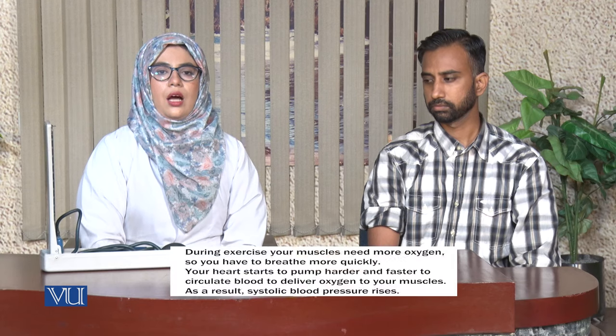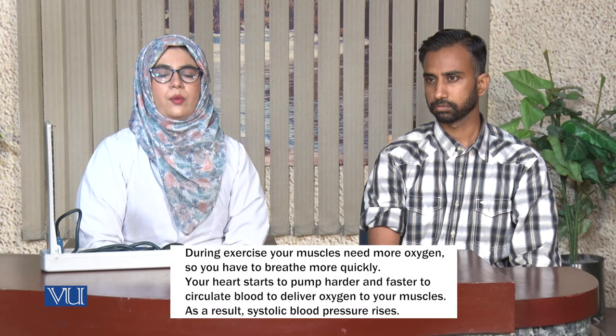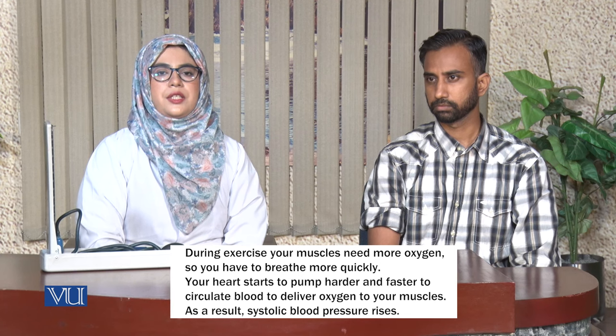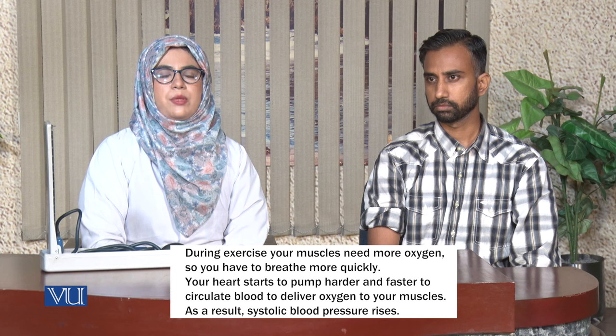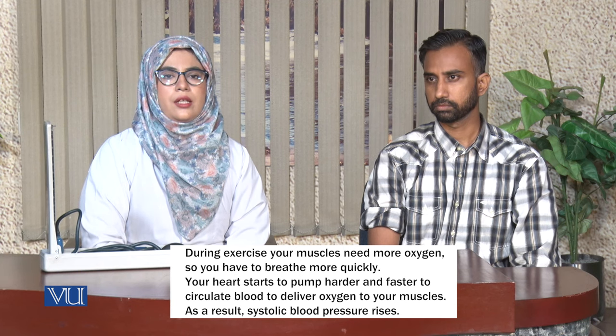Dear student, now the subject has high blood pressure, which is 130 by 90 millimeters of mercury. Now you can note the difference between normal blood pressure and the blood pressure after exercise. There are different precautionary measures while taking blood pressure using a sphygmomanometer.